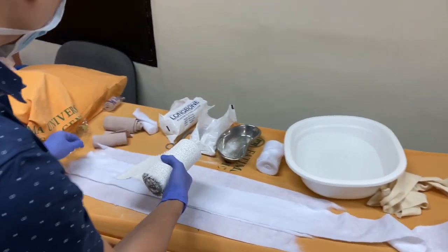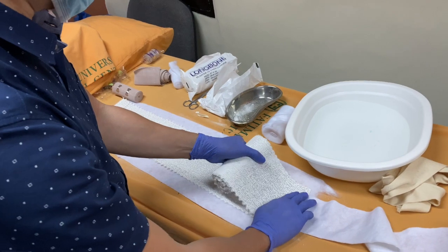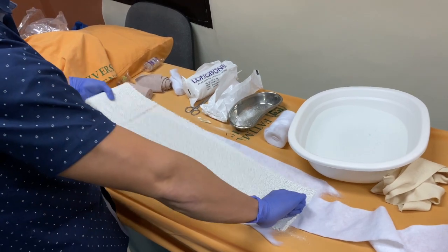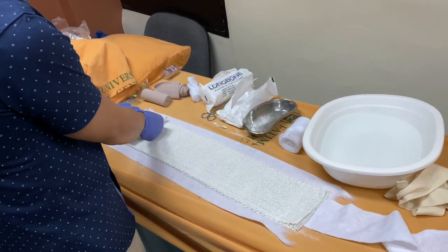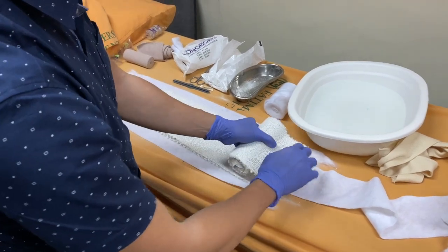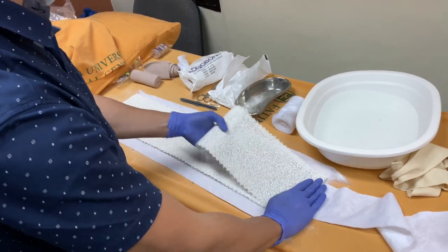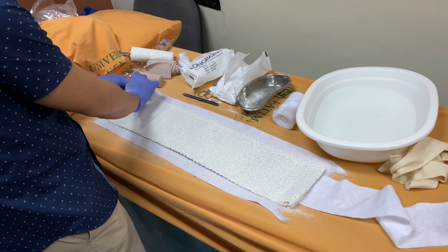We'll be using the POP or plaster of Paris mold. For upper extremities, ideally 10 to 12 layers. For lower extremities, we'll be using 12 to 15 layers. So we'll just use 10 layers here. We have the desired number of layers — the limb is ready, prepared, and the elastic bandages are ready.